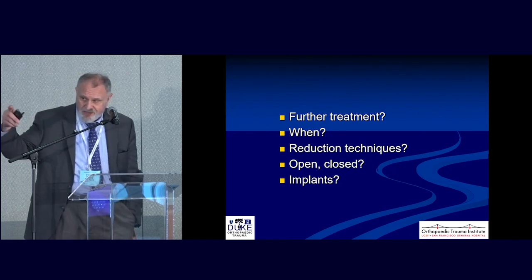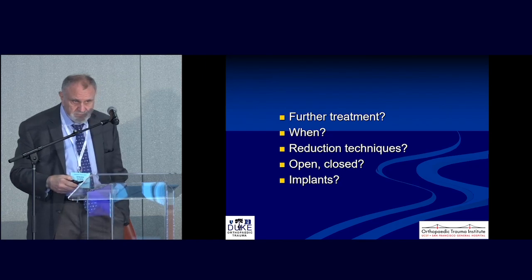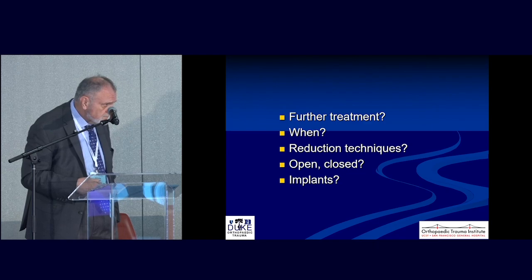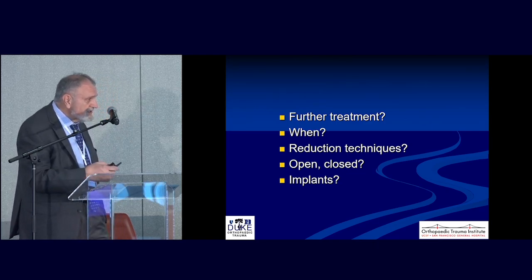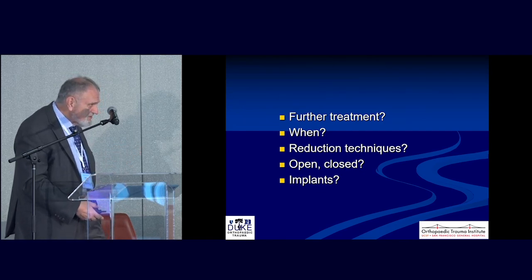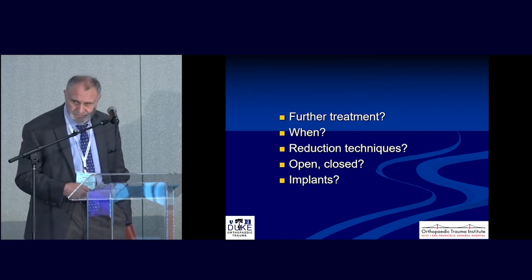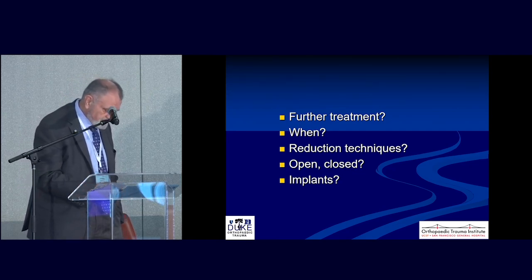Would everybody get a CT, anybody not get a CT for this? Are both of those open? Yeah, both open. My philosophy is a CT is an expensive exam, it takes some time, it exposes the patient to radiation. Is it going to change my management? For distal femur fractures, it might make a little different incision, but a lot of times it's not going to change the plan. If you know it's intra-articular, you're probably going to do a midline patellar arthrotomy anyway, as opposed to a direct lateral. Is that your point, Andy? Yeah. Looking at these x-rays, I might be comfortable going without a CT if for some reason they didn't have one already, rather than go back to get a second one.